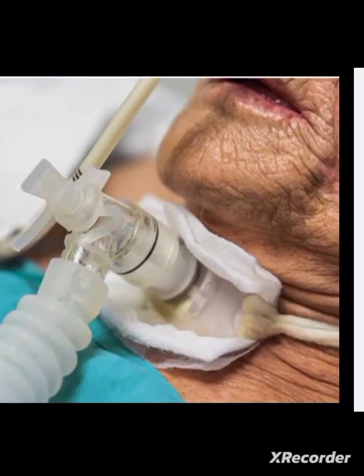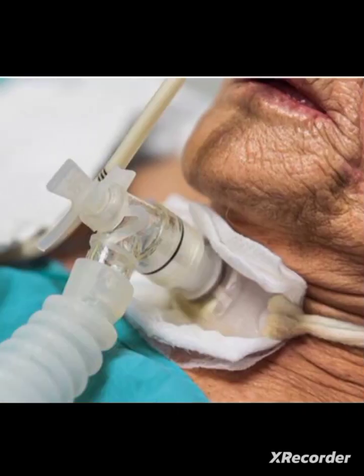Okay. Next one, tracheostomy T-bar. In the tracheostomy T-bar, a T-piece is connected to the tracheostomy, and through this we give O2. This tight fit allows better O2 and humidity delivery than the tracheostomy collar. That is the merit of the tracheostomy T-bar.